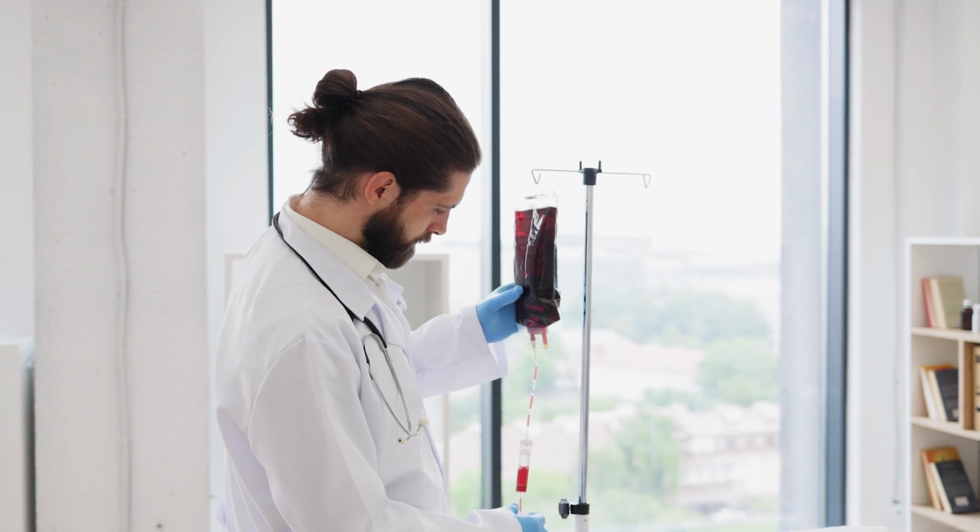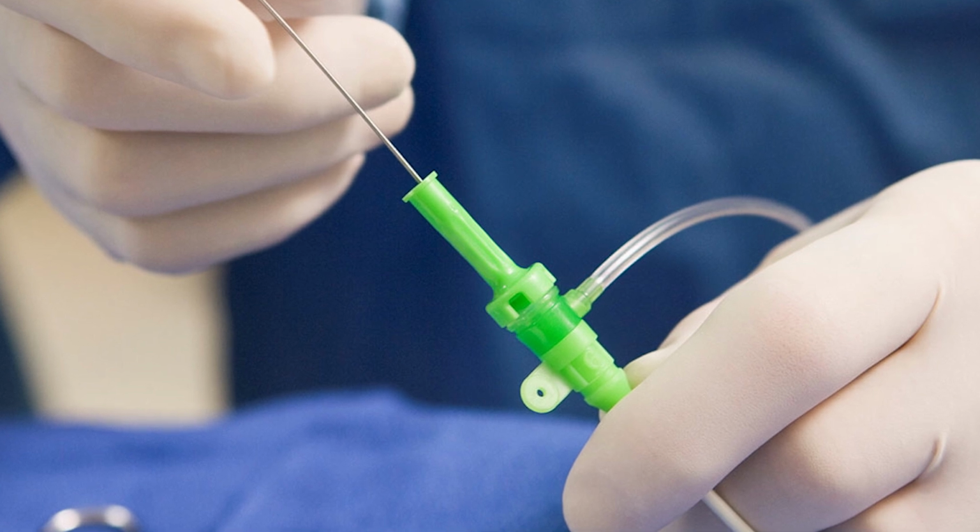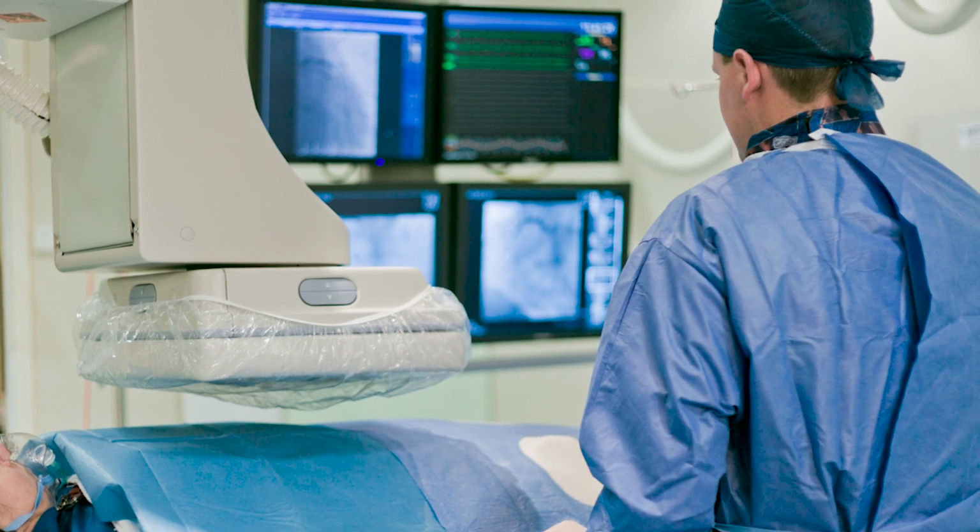It is usually very simple, but it's important to know that there is a small risk of a bleeding complication with this procedure. Bleeding complications are very rare, but they happen. They could require you to stay overnight. They could require a blood transfusion, especially if your hemoglobin is already low, and could even require another procedure called an angiogram to stop the bleeding. Again, in our practice, we do hundreds of medical renal biopsies in a year, and the risk of complication is 1% or less. If you're curious, an angiogram is a procedure where we inject a little spaghetti-type tube in your groin, and then we can navigate under x-rays to the kidney and find the small blood vessel that is causing the bleeding, so we can block it.